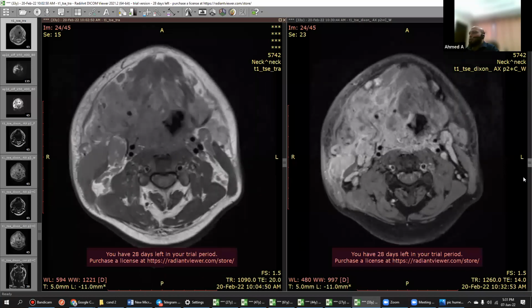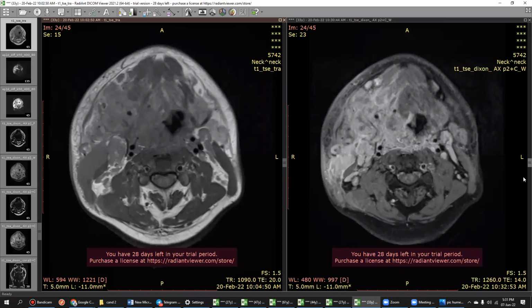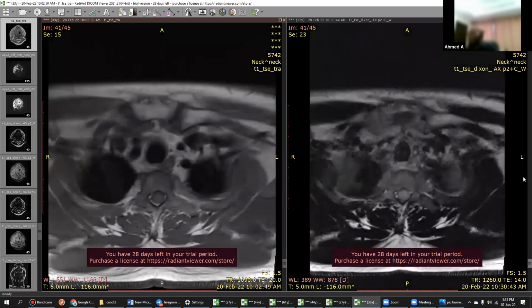You should ask the examiner the clinical picture. I would correlate to the clinical picture, whether the patient has fever, pain, redness. Yes, the patient had fever, the patient had a lot of pain, excruciating pain. Okay. Yeah, because it could be both of them. So I will look at the inflammatory markers. So where do you think the infection is coming from? Any clue in this? It's a bit difficult, but yes. It's multi-compartmental, so what do you do next?